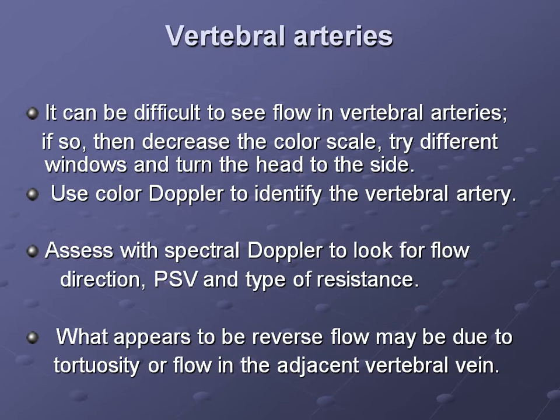What appears to be reversed flow may be due to tortuosity or flow in the adjacent vertebral vein. So you should be careful when you report reversed flow in the vertebral artery. You should be very sure that there is reversed flow, because this indicates subclavian steal syndrome.